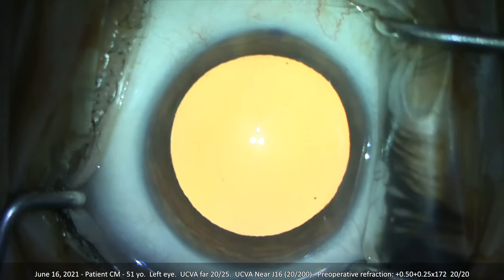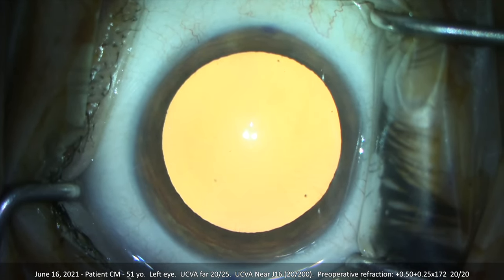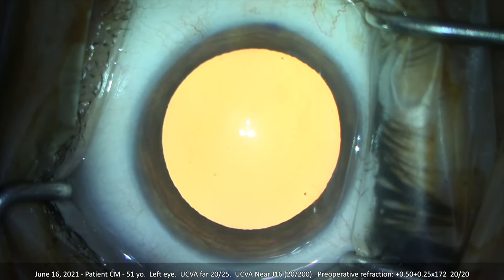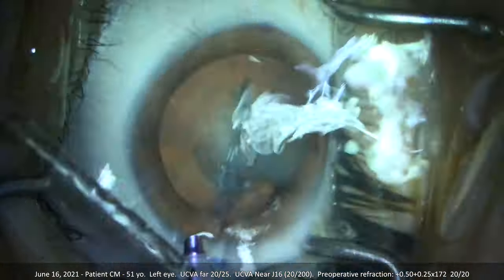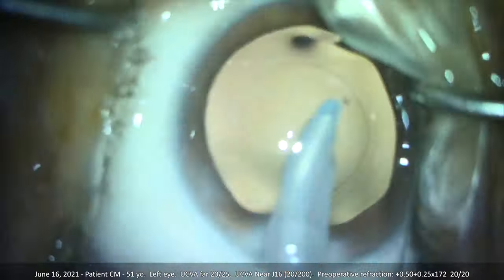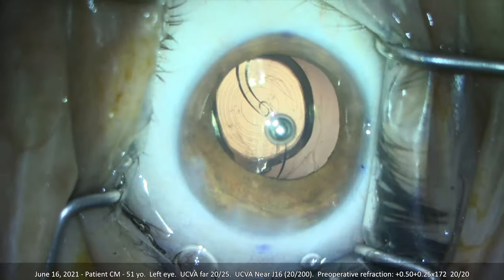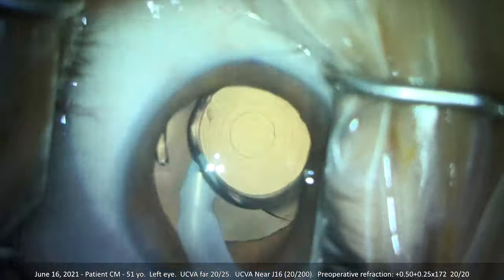Here's a surgical video from our first day using the Synergy. This patient is a 51-year-old woman who has pretty good far vision without glasses — she's 20/25. She uses progressive glasses when she wants to see mid-range and up close. She drives without glasses but wants to see better at the computer and up close without relying on glasses. About 30% of my surgical patients are like this patient — they want elective premium lens replacement to help them see better across the visual range from far to near.